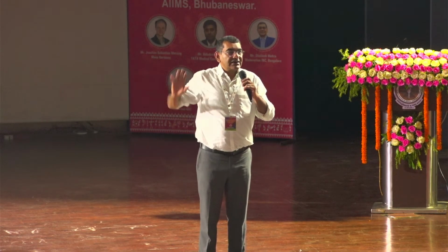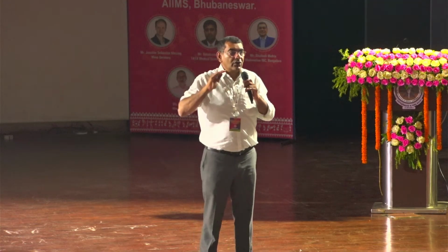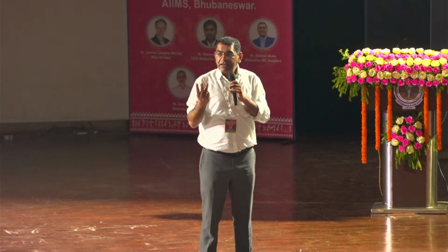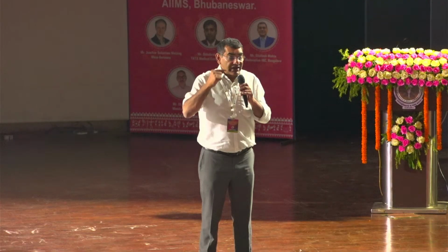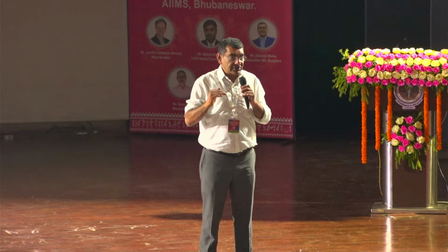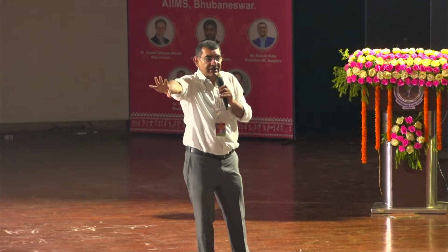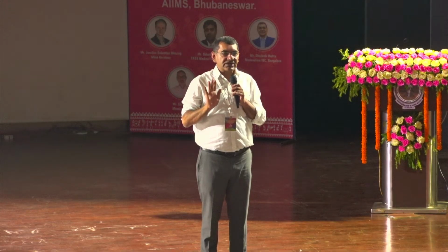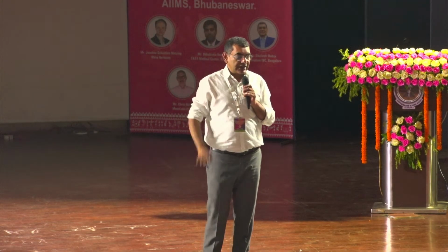दूसरा भेजो. अब 10वें बाउल में growth आया. 10 into how many days? She's taken 3 days, or he is taken 3 days. कितना दिन हुआ? 30 दिन. तो 30 दिन एक्सपायरी नहीं देते. Divide by 2. Safety margin becomes 15 days. So जब आपका सबसे गंदा एरिया 15 दिन दे रहा है, तो आपका OT और CSS जो उससे अच्छा है क्या गंदा है? Set that as a protocol.